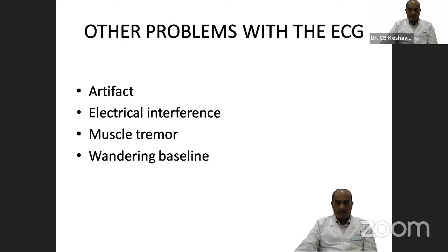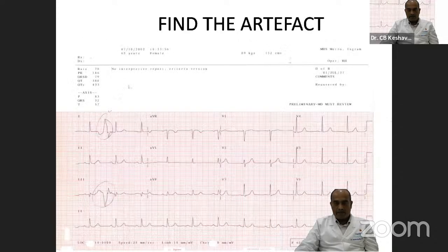That removes most of the electrical interference. If the patient is wearing some metallic objects or something is grounding or causing an electrical disturbance, you can remove those objects and transiently switch off other monitors and things like mobile phones, which may cause electrical interference. So that will give a proper ECG. Artifacts, of course, I'll tell you how to read and separate them.